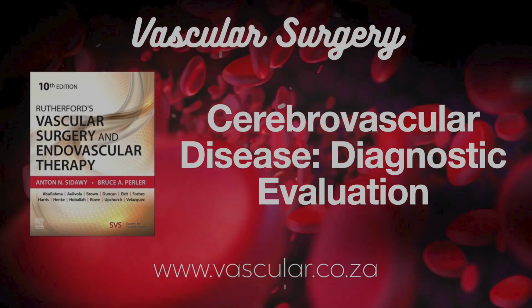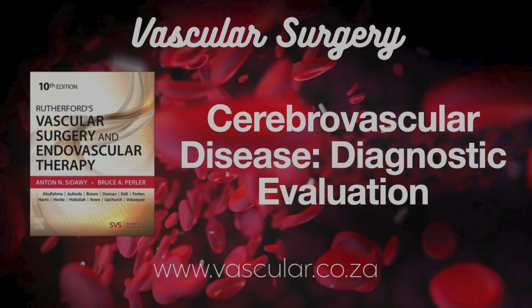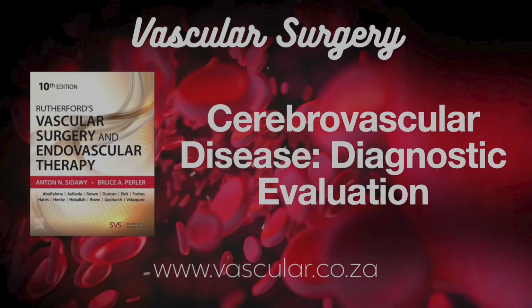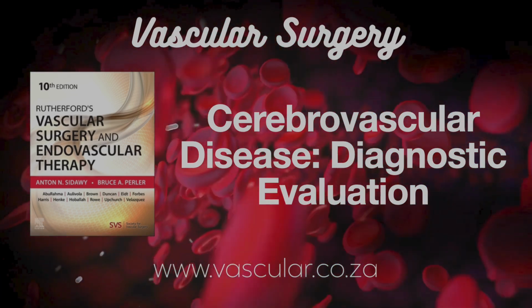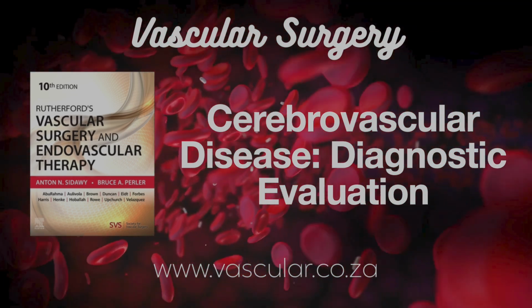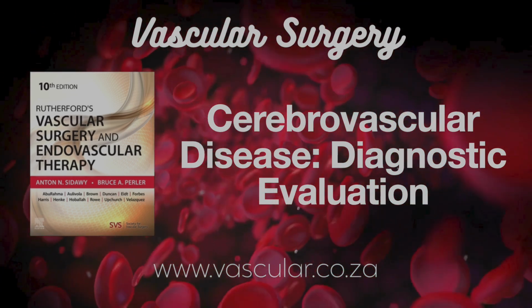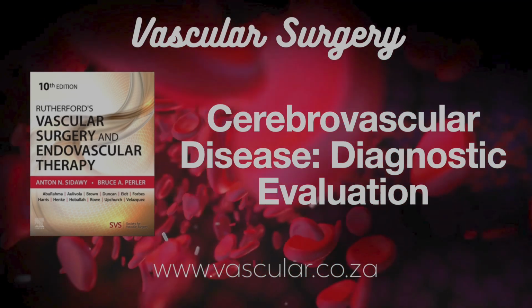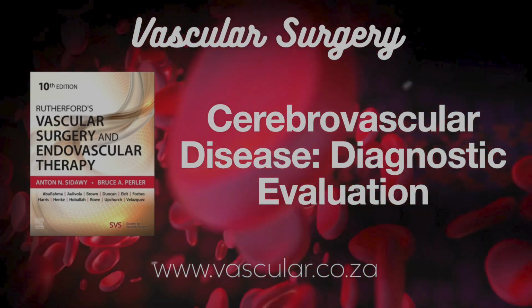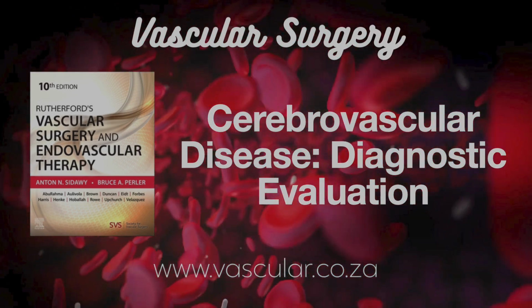Right, MRA. For carotid disease outside the skull, we mainly use two types. CE-MRA, which is contrast-enhanced MRA using a gadolinium-based contrast. Different contrast than CT. Different contrast, yes. And TOF MRA, which stands for time of flight, and that one doesn't need any contrast at all. Interesting. What are the general plus points for MRA? Big advantages. Totally non-invasive and zero ionizing radiation, unlike CT or DSA. It's a major plus. Huge.